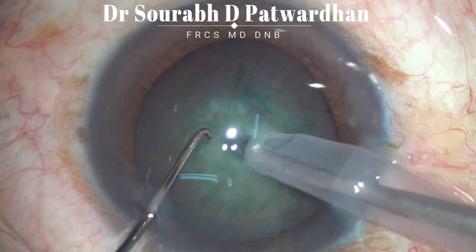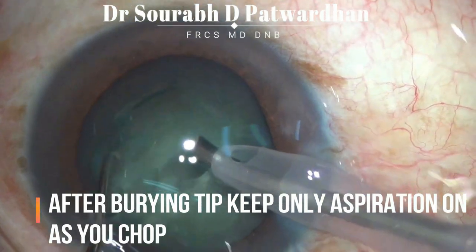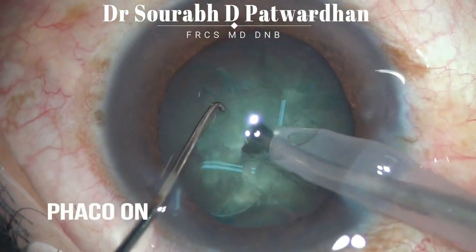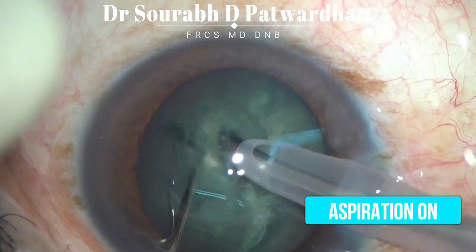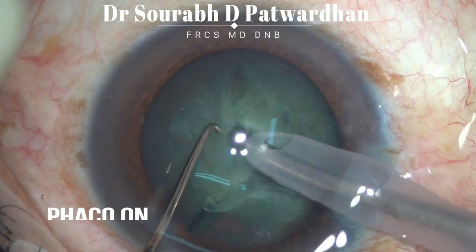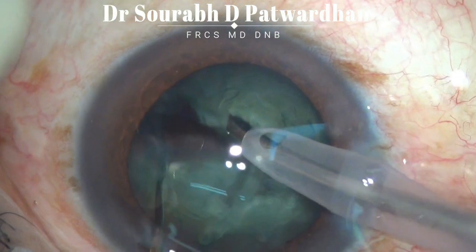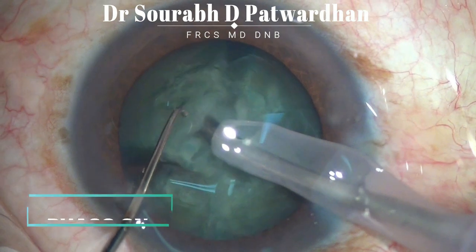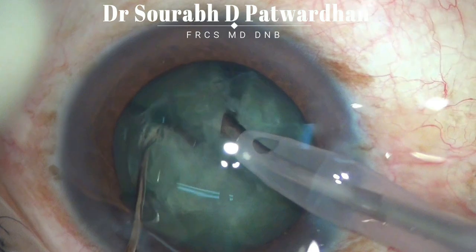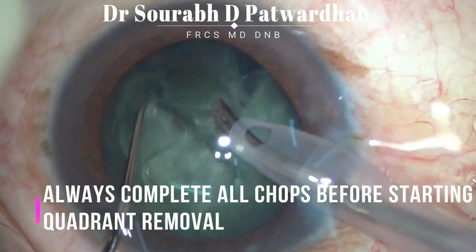For achieving safe chop, it is important that you bury only the exposed tip, and after burying the tip, keep only the aspiration on — do not give FACO power when the tip is buried. FACO power is on when you bury into the nucleus, but once buried, you stop the FACO power and keep only aspiration on. If you continue to apply FACO power when the tip is buried, there is a chance you may punch through and cause a posterior capsule rupture.